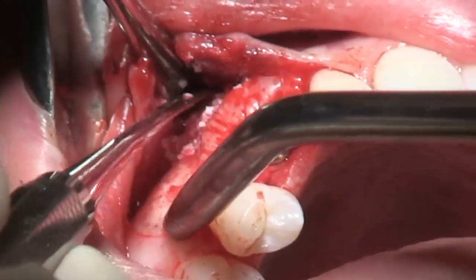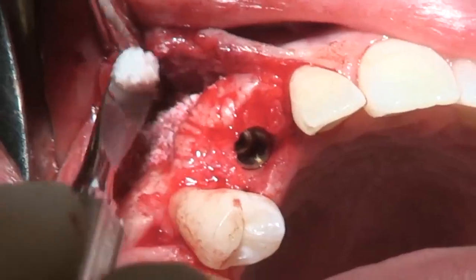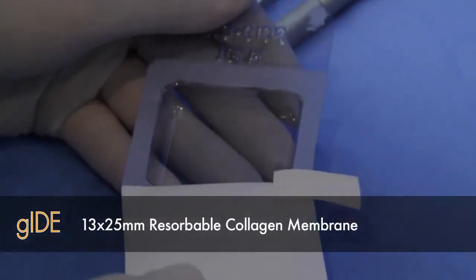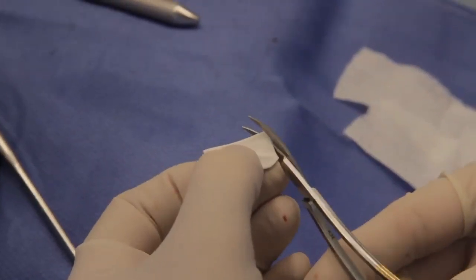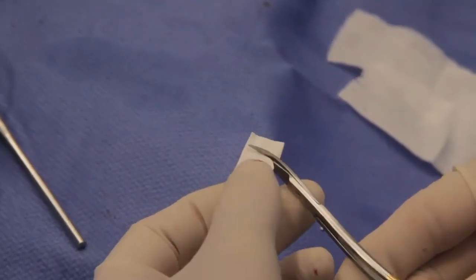A GBR resorbable natural cross-linked collagen membrane was used in the size of 13 by 25 millimeters, and the corners were rounded and trimmed to fit nicely over the bone defect and over the previously applied bone graft material.